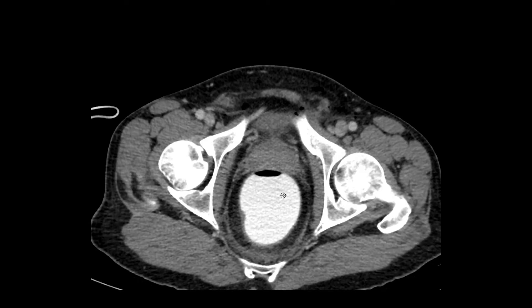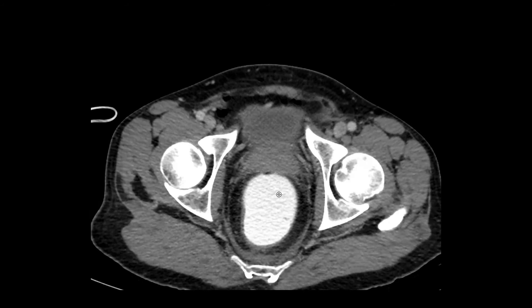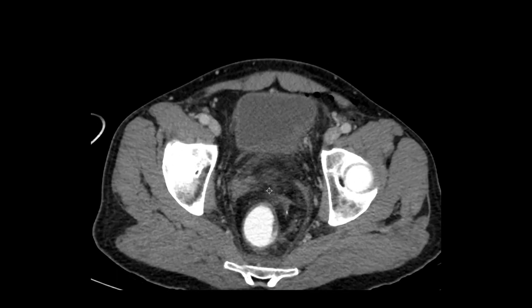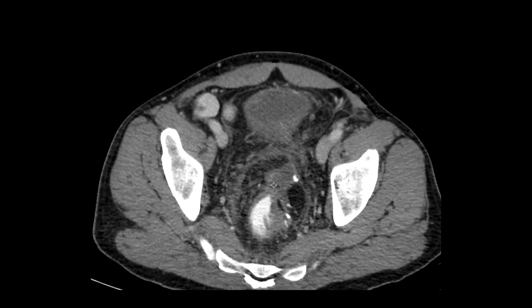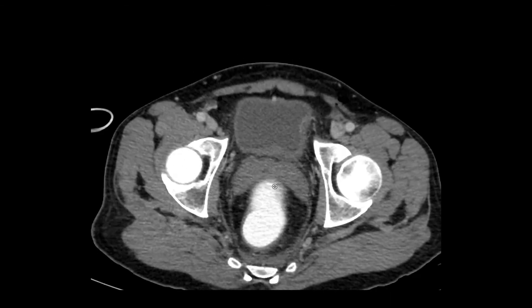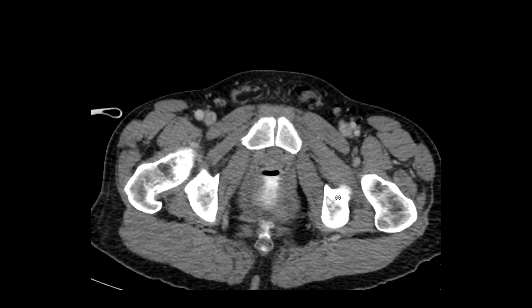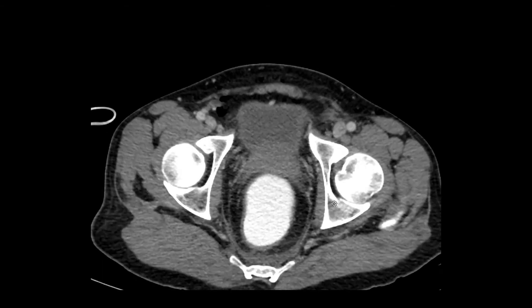You could do that — we did it in this case to honor his request — but you really only need to do that if the anastomosis is really low, like just above the anus, because there's no way the rectal tube is going to reach that far up. We didn't have to do it in this case, but we did and everything worked out fine. Other options: if you don't want to remove the catheter, you just don't have to blow up the balloon. You can use the big rectal tube you normally use for barium enemas and just not inflate the balloon. If there's a very low anastomosis near the anus and you don't want to use that larger rectal tube, you can use a Foley catheter or red rubber catheter and also not blow up the balloon.